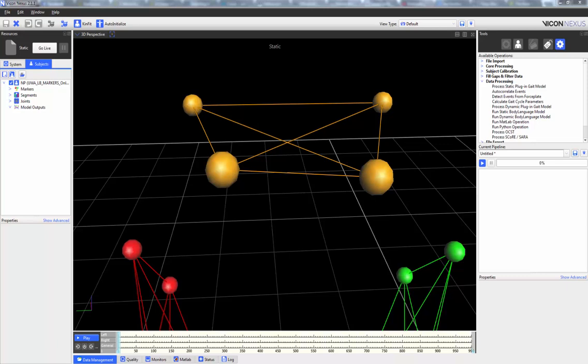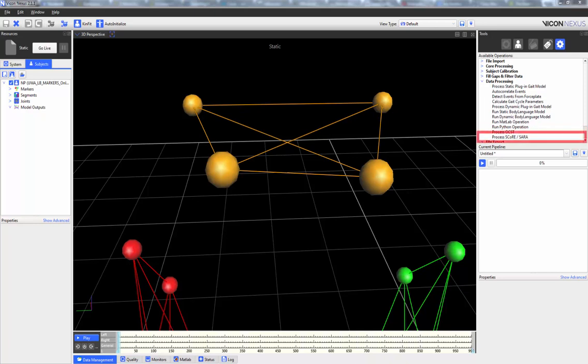For more information about the last two data processing operations — Process OCST and Process Score and SARA — please refer to the video dedicated to calibrating and processing Score and SARA.